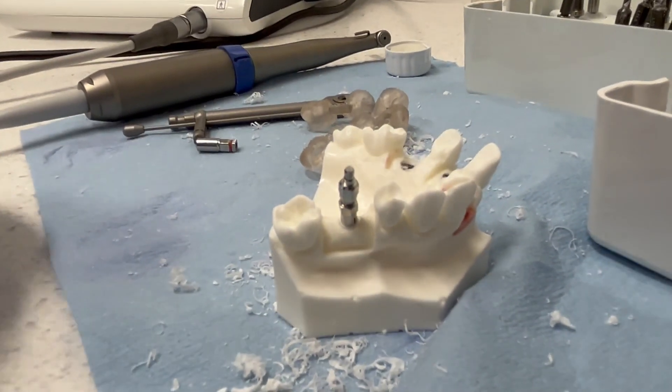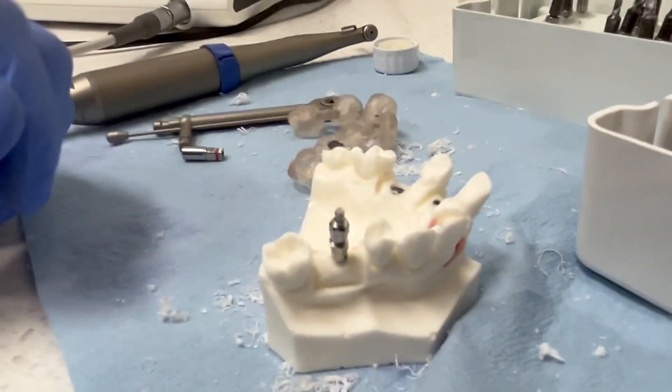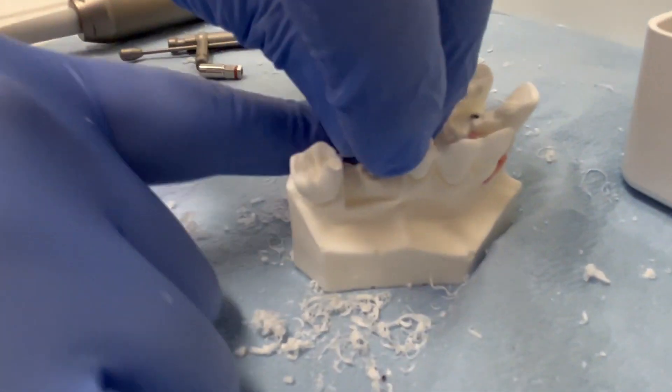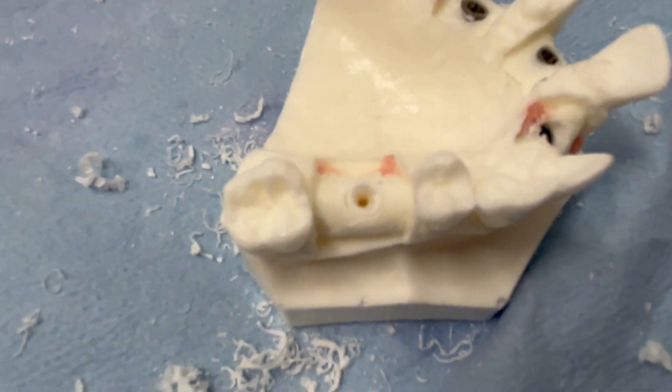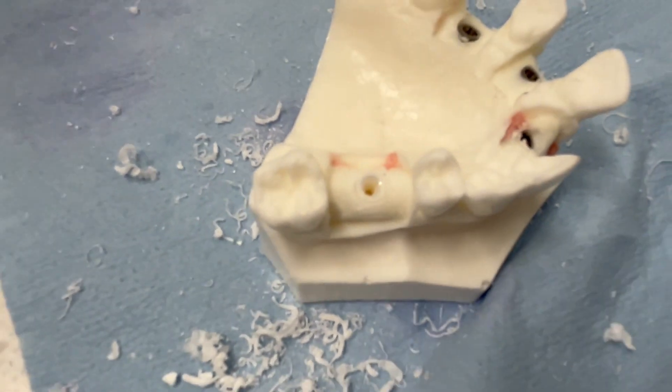There's our implant placed. Everything looks good. And then we will just pop the mount up. Out of the implant. And there you can see our ZI implant placed right in the middle of the ridge. It's awesome.